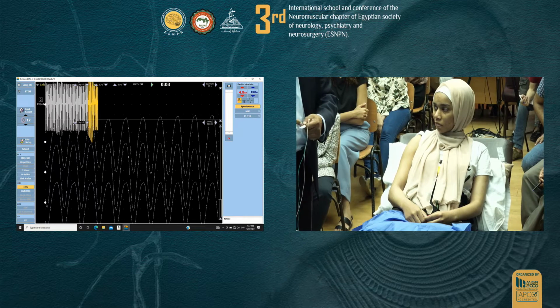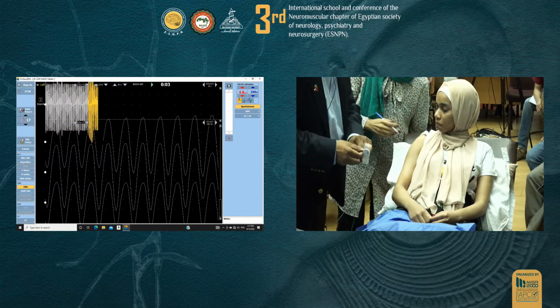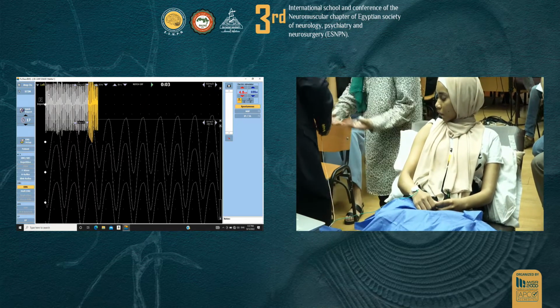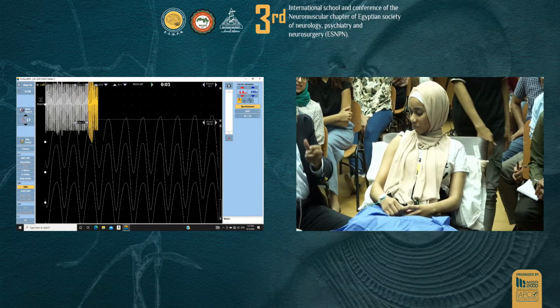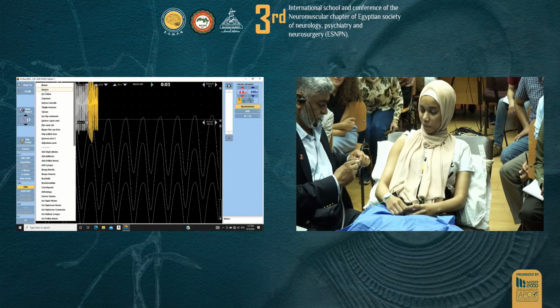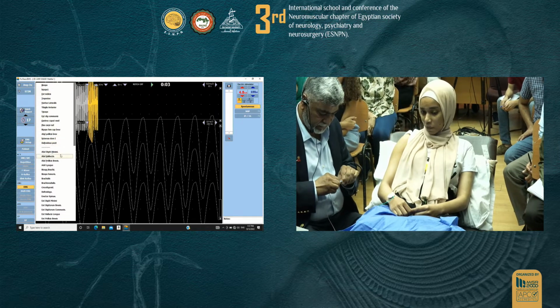Yeah, they are more sticky for sure. I wish you had this in the morning, man. They are definitely more sticky for sure. I can tell even now. What's that? Oh, that'll be great. Thank you so much. I love that. I do it sitting always, yeah. Okay, guys, should we get started? Deltoid. Bismillah. Okay, good. Do you have some cleaning gauze?